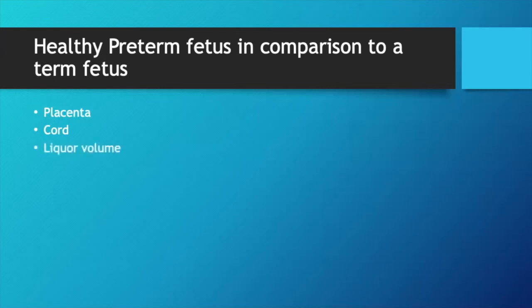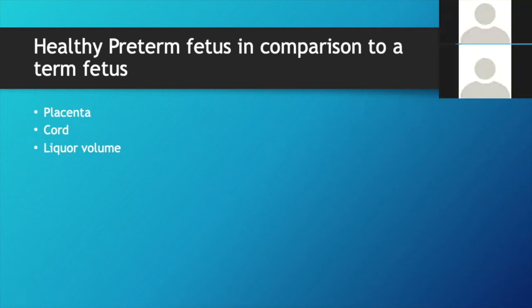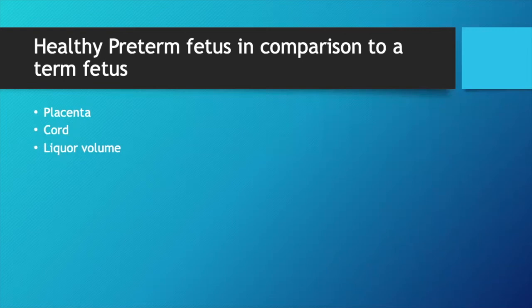What about liquor? I'm not sure it's necessarily different. You need to try and help Sarah out. Go down to DAU. Proportional.